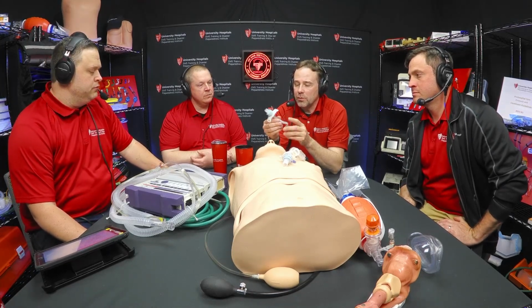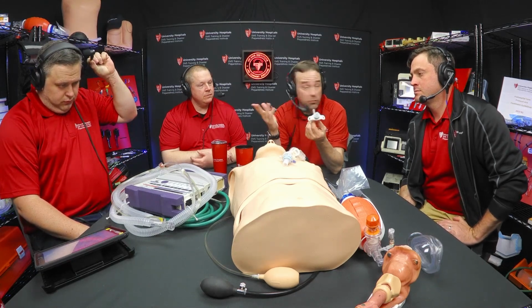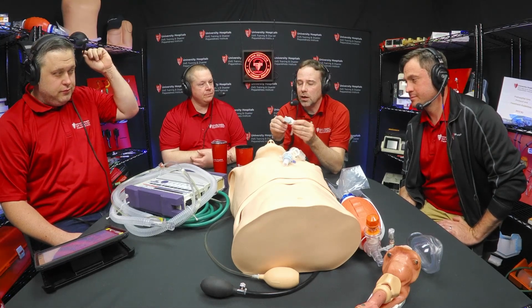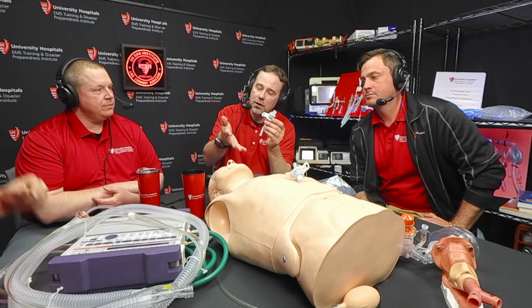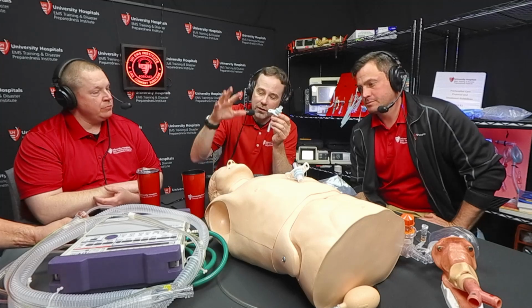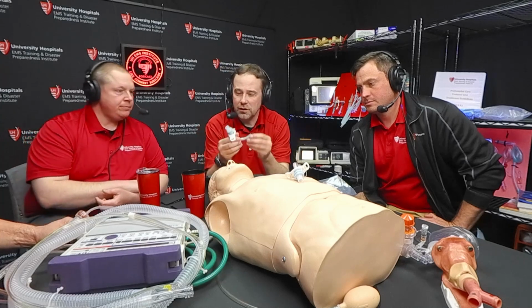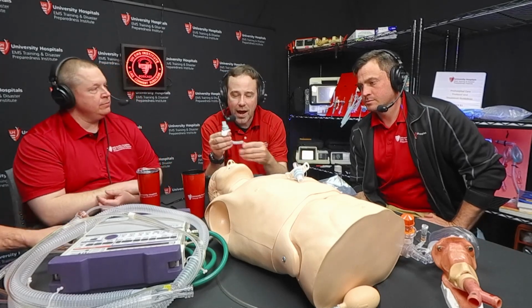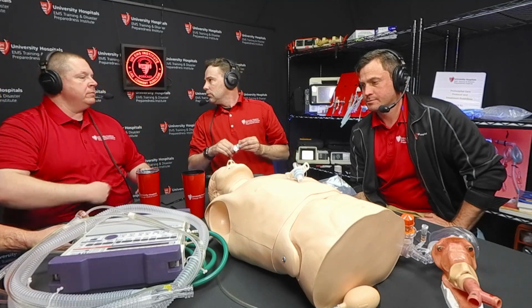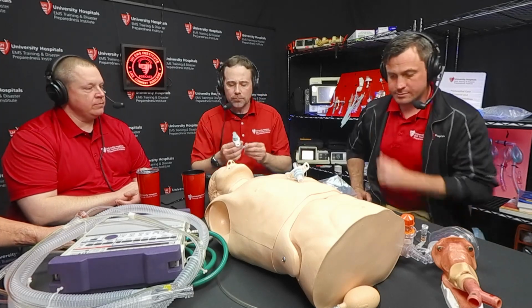The cases where you might find somebody with an uncuffed tracheostomy are generally those patients that are spontaneously breathing. This patient has some sort of upper airway problem, probably chronic. Maybe it's tongue or tracheal cancer, they've had facial trauma, or something that has affected the airway from the neck up, and we just need essentially a different blowhole. We need a different lower access into the airway, but they've got no compromise of breathing. They don't have a spinal cord injury, they're breathing on their own. They just need an alternate passage for air. And that's where you'll see these patients.